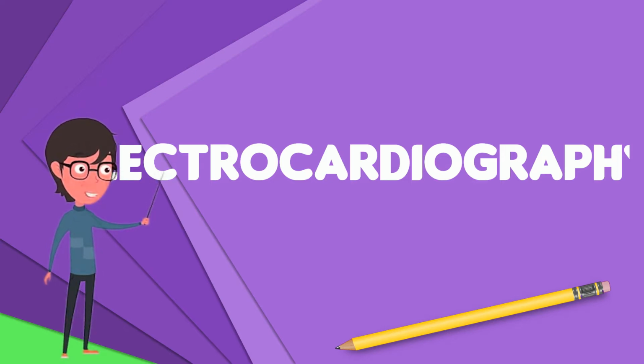There are three main components to an ECG: the P wave, which represents the depolarization of the atria, the QRS complex, which represents the depolarization of the ventricles, and the T wave, which represents the repolarization of the ventricles.